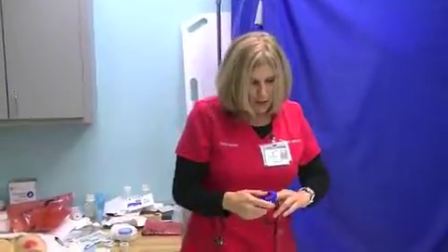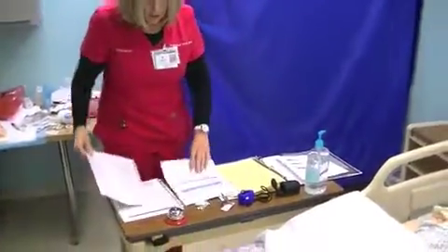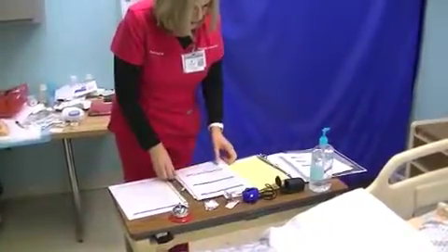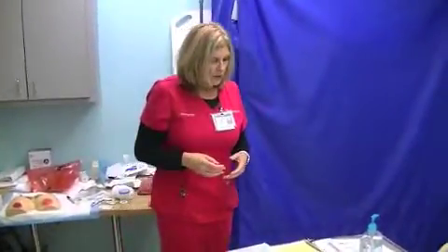And when it's no longer needed, we're going to remove the oximeter from the finger. We also want to make sure that we demonstrate this for the caregiver if you're having to do this at home, and also teach them the significance of the results. Now, SaO2 readings, like I said, mostly is 95 to 100%. That's normal, healthy adult.